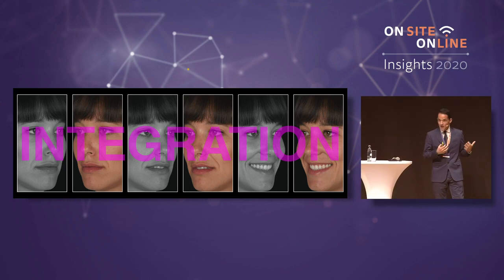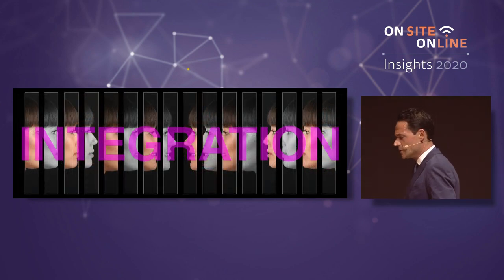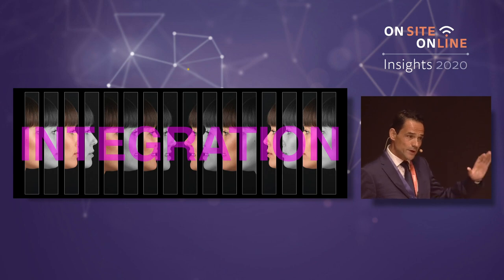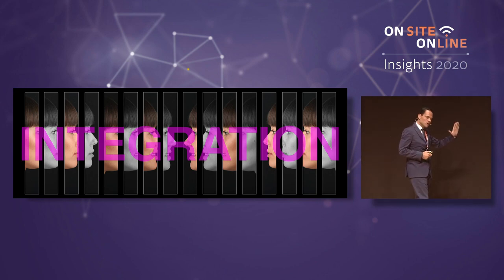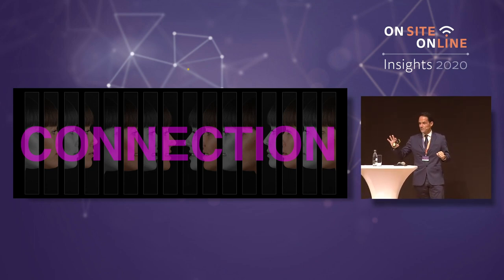I still remember the first time I received a planification-based Keynote, and opened the email. What's that? I still remember the first time that the doctor sent me some images of the patients they want to make a virtual wax-up, please take into consideration, blah, blah, blah. It was really difficult. It was completely important not to make the mistake to change things during the treatment. So the connection between this planification, the connection between these images and the 3D models I have in front of me, or the plaster models I have in my hands, is extremely important. Otherwise, I'm completely lost, because I'm not going to be able to connect the patient and my dental project.